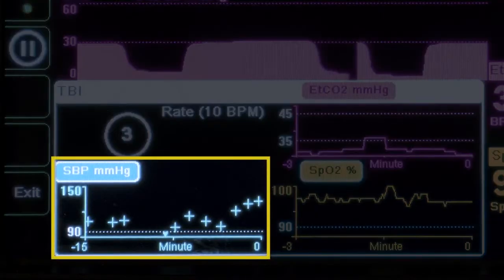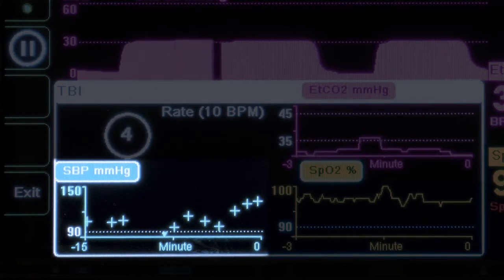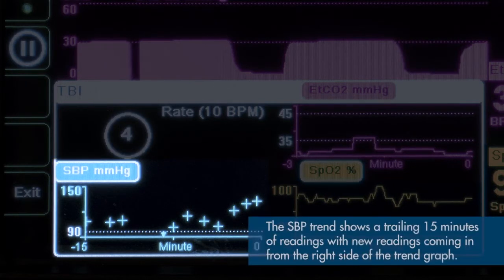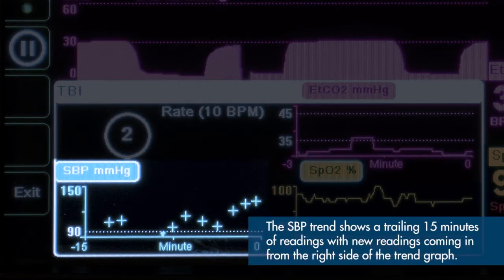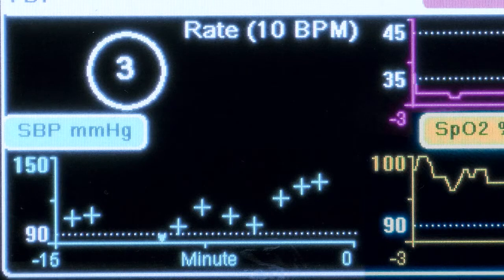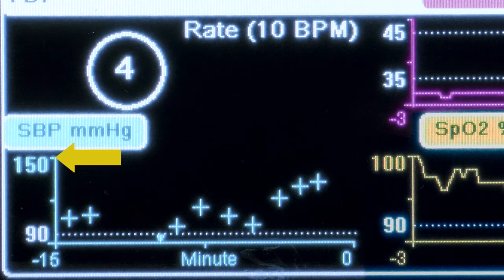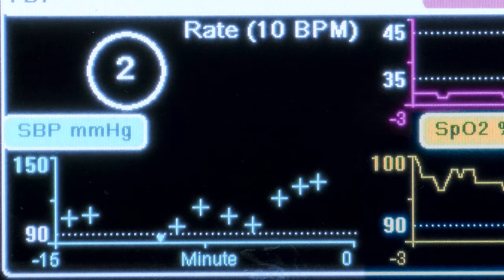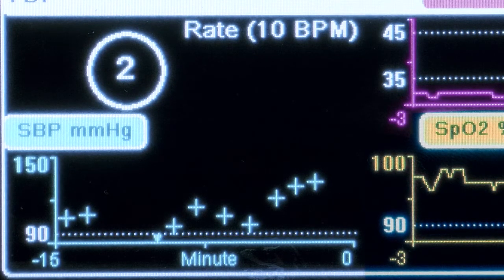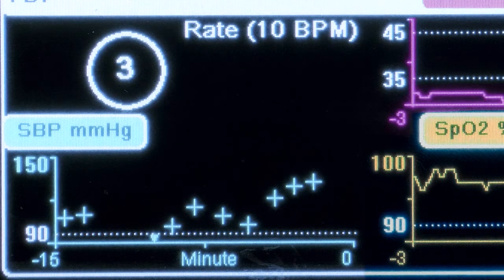Next, we will cover the systolic blood pressure trend. The trend graph shows systolic blood pressure, measured in millimeters of mercury (mmHg), over time. The SBP trend shows a trailing 15 minutes of readings, with new readings coming in from the right side of the trend graph. The default viewable range is a low of 85 systolic to a high of 150 systolic. There is also a supervisor-configured low systolic pressure limit, shown as a white dotted line on the graph.